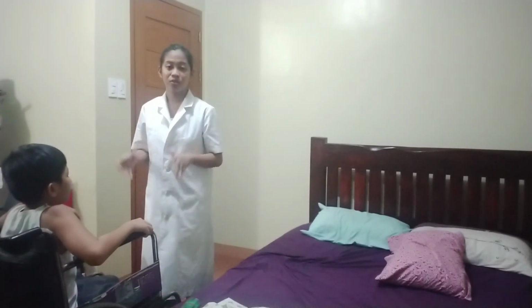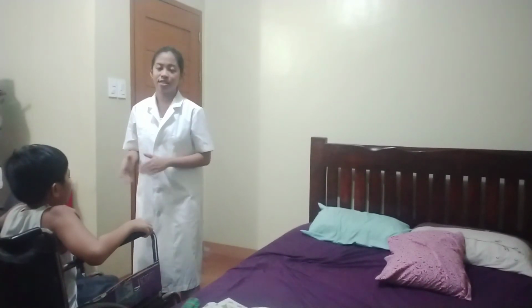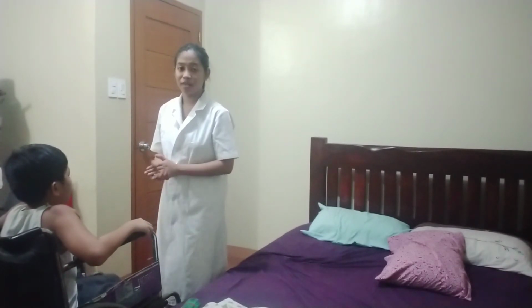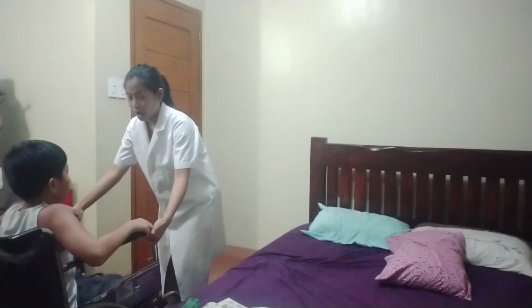And as I do the procedure, I am flexing my hips and my knees in assisting the patient. Now, I will assess the alignment of the patient in the wheelchair. Okay, sir, okay lang po ba kayo?